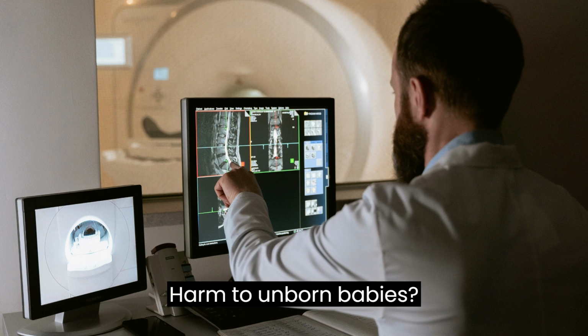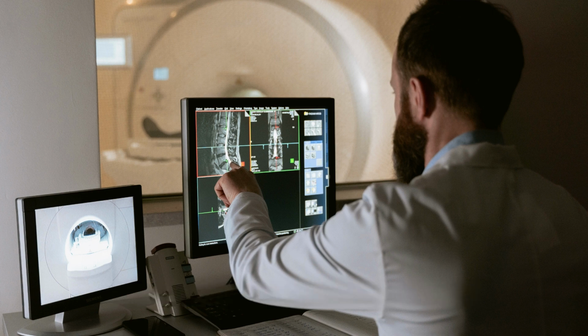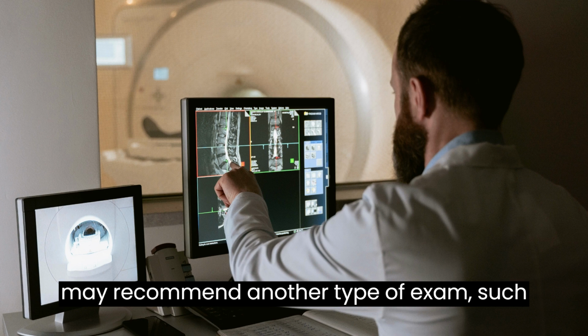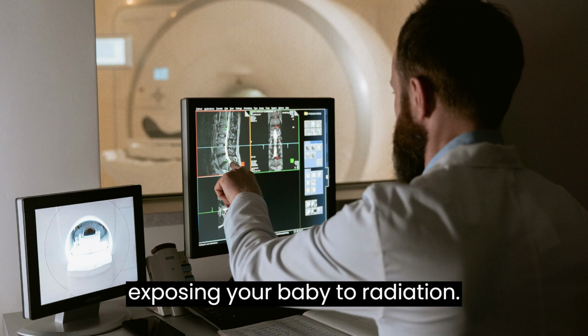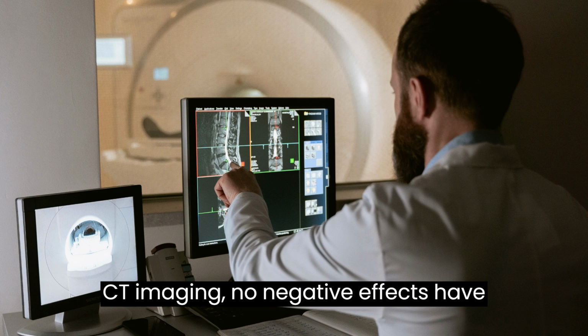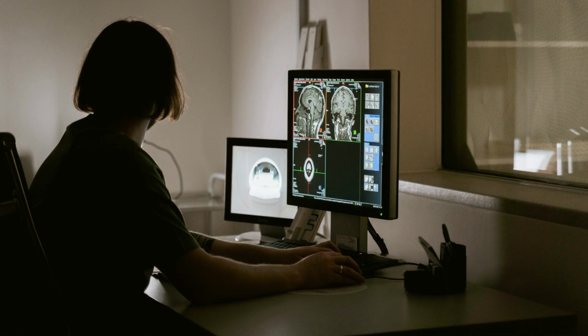Harm to unborn babies. Tell your doctor if you're pregnant. Although the radiation from a CT scan is unlikely to injure your baby, your doctor may recommend another type of exam, such as ultrasound or MRI, to avoid exposing your baby to radiation. At the low doses of radiation used in CT imaging, no negative effects have been observed in humans.